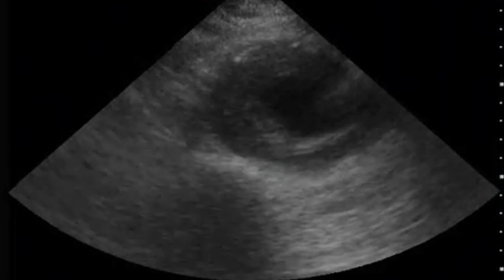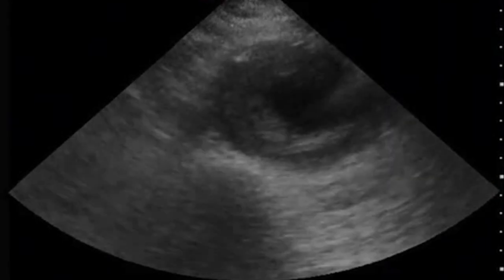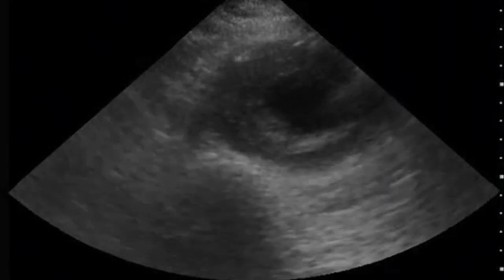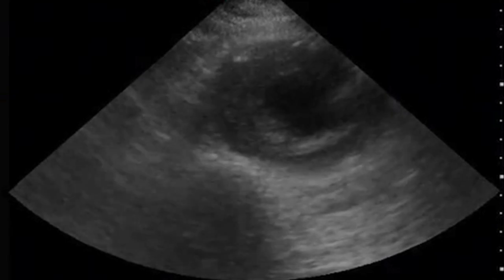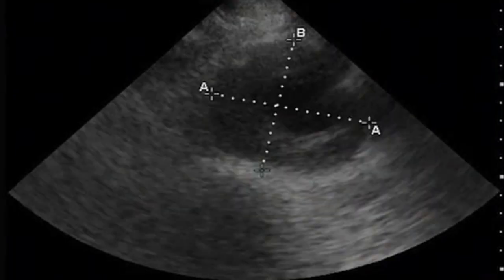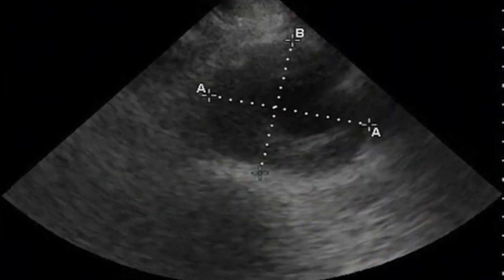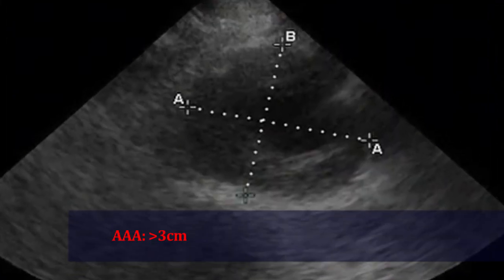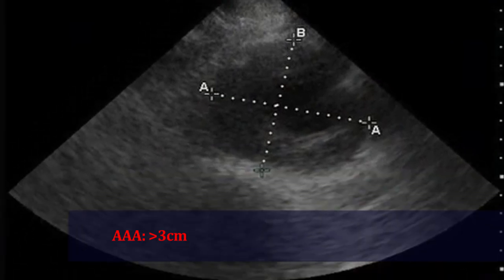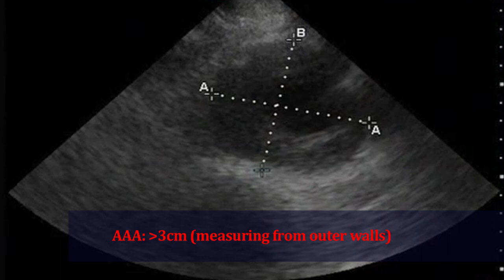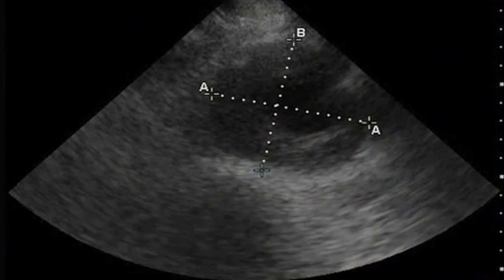Here's an image of an abnormal exam. When we think we're looking at a AAA, we freeze the image so we can take two perpendicular measurements. If the diameter is greater than three centimeters, we're looking at a AAA. Notice how we're measuring from outer wall to outer wall — measuring just the diameter of the lumen would actually miss a lot of AAAs, so remember to measure from the outer wall.